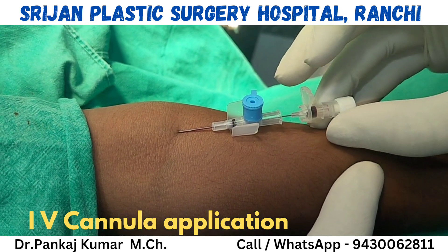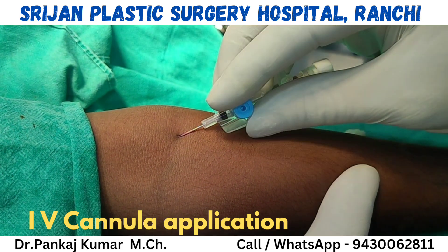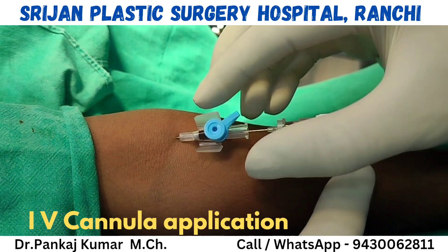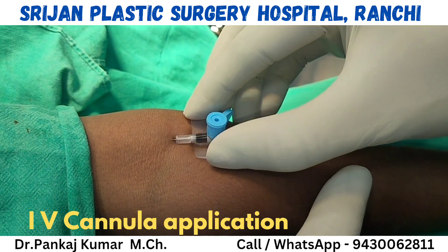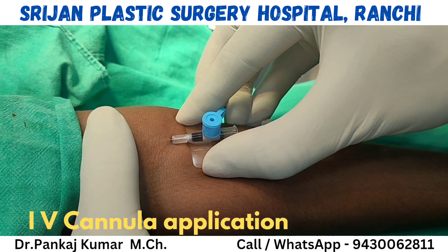By pulling the stylet backward and pressing the cannula inward, the cannula is now totally inside the length of the vein.